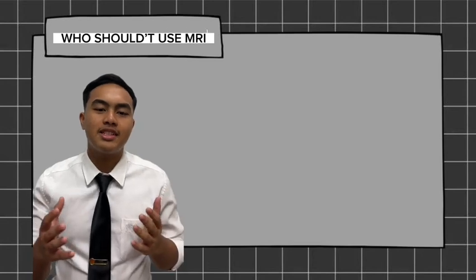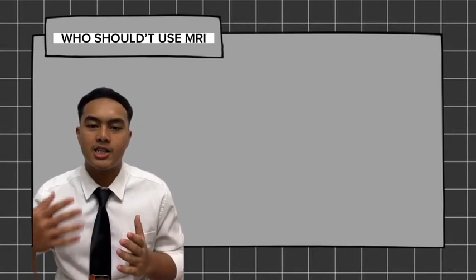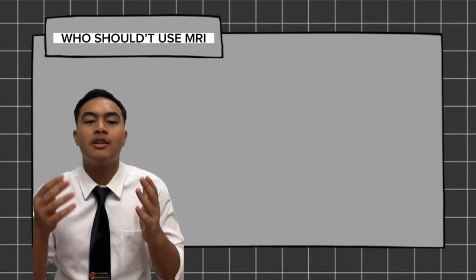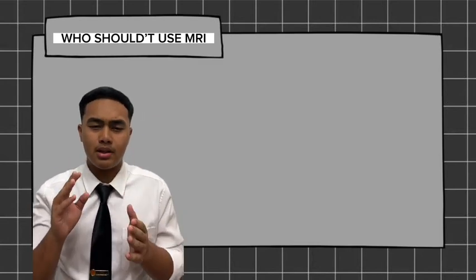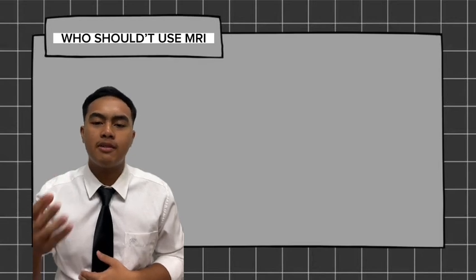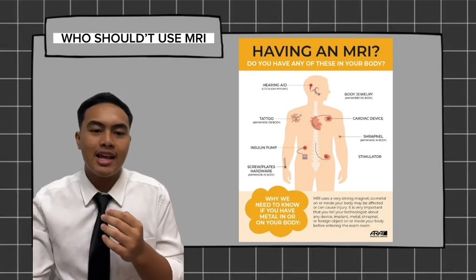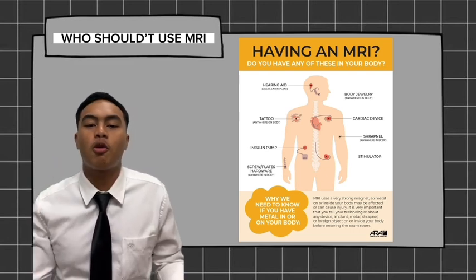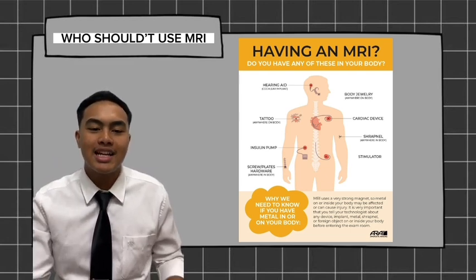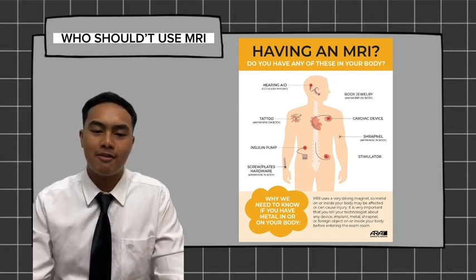In most cases, an MRI exam is safe for people with metal implants, except for a few types, unless the device you have is certified as MRI safe. You might not be able to have an MRI. This device may include metallic joint prostheses, some cochlear implants, some types of clips used for brain aneurysms, some types of metal coils placed within blood vessels.